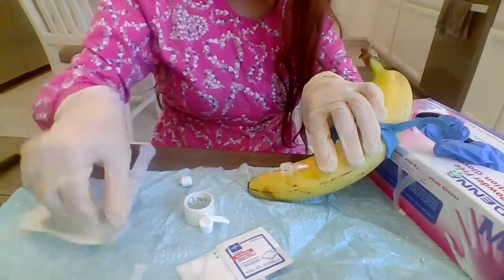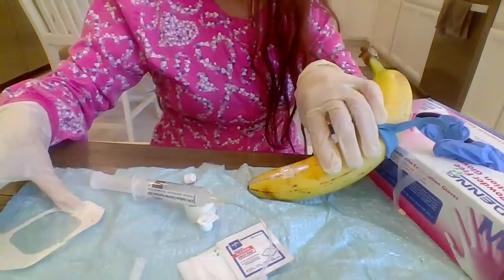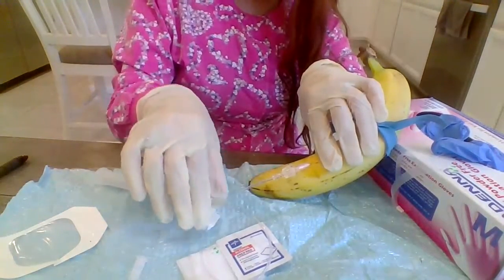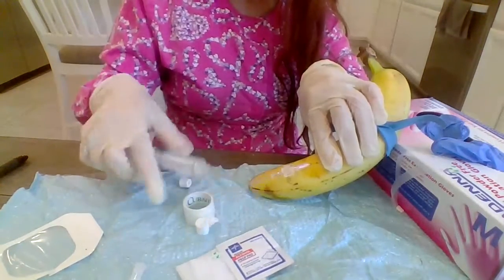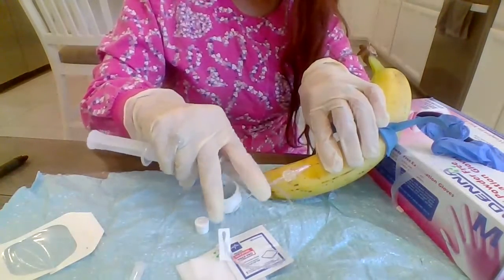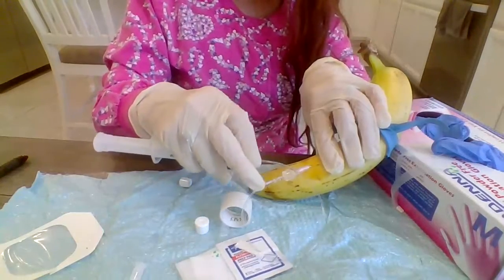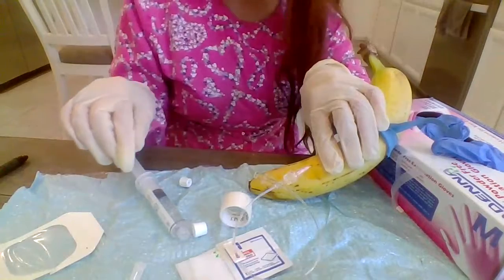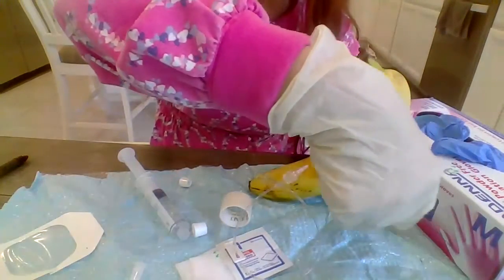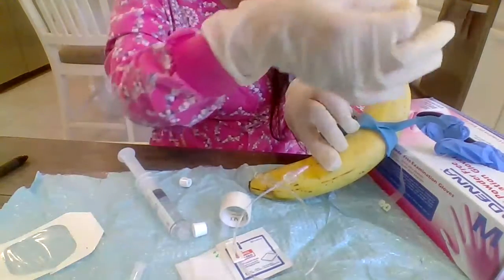Let's go ahead and lock it, and now I'm going to disconnect the saline, and I'm going to go ahead and tape this.